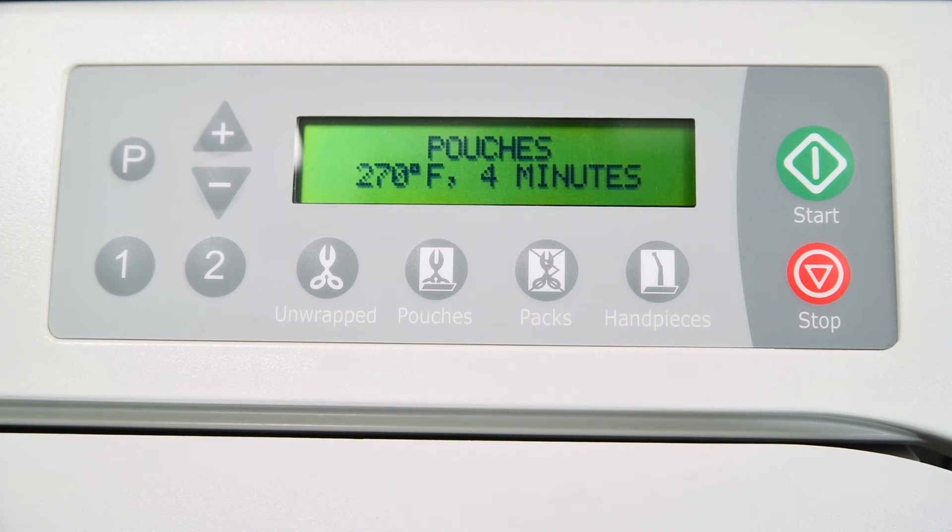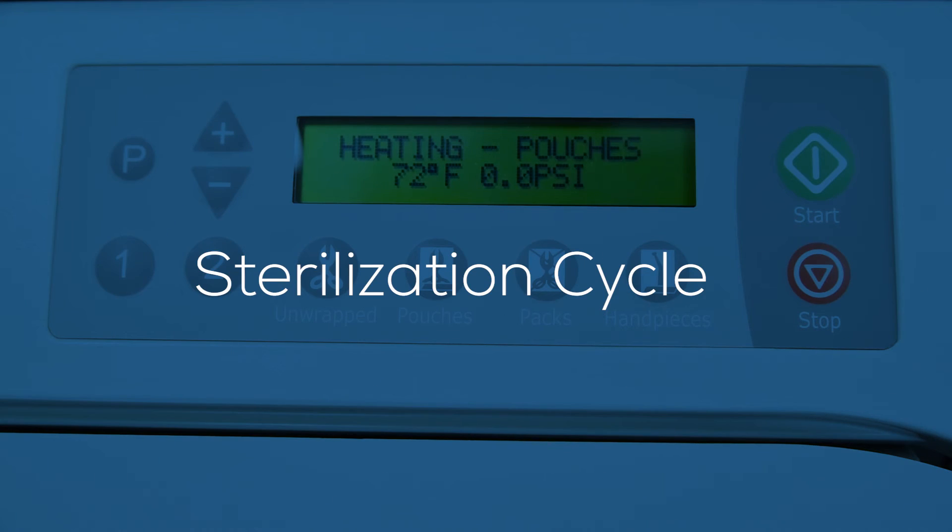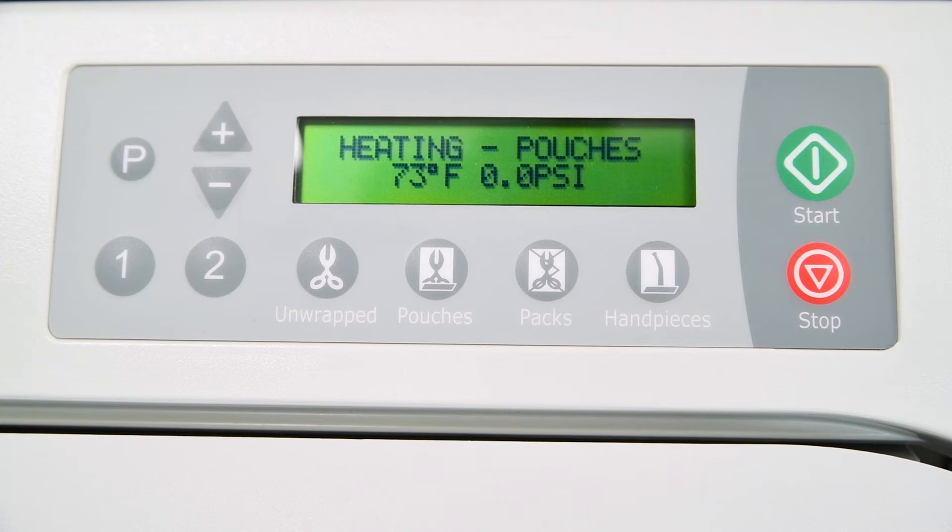Once you have made your selections, press the start button to begin the sterilization cycle. The display will now show the message filling chamber, followed by chamber is full when the proper water level is reached. The unit will now begin to heat to the appropriate temperature for the selected cycle, and the display will change as the temperature and pressure in the chamber changes.